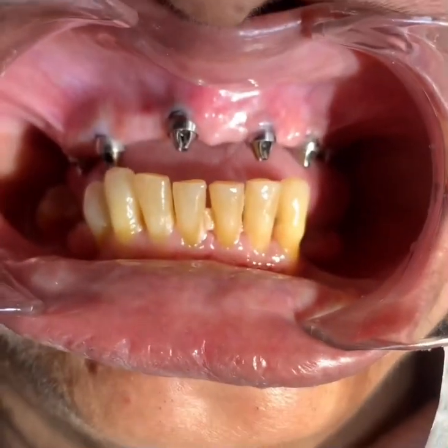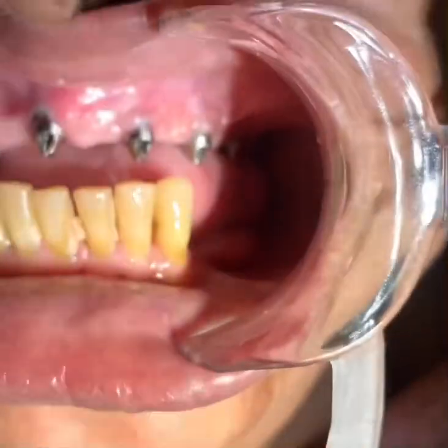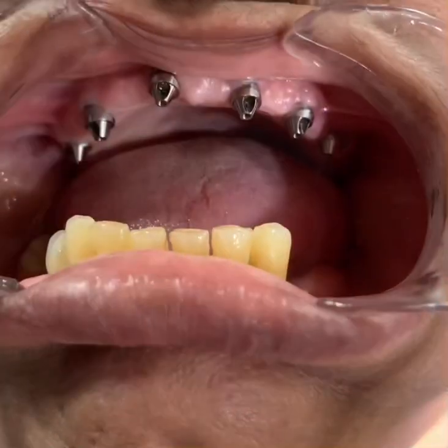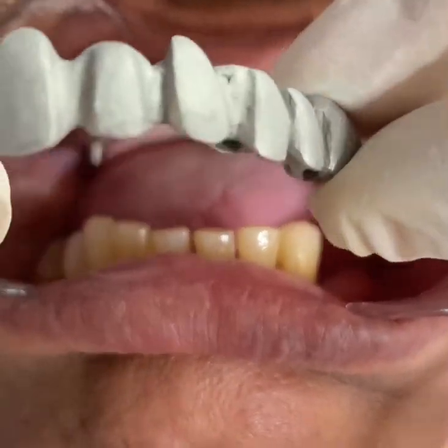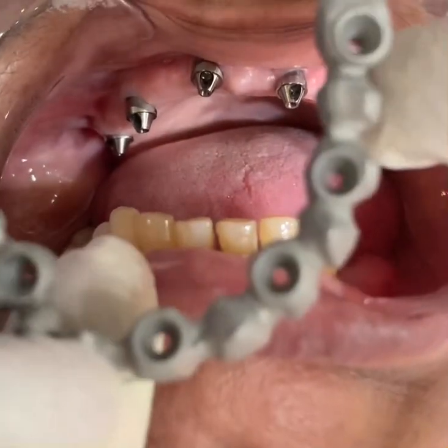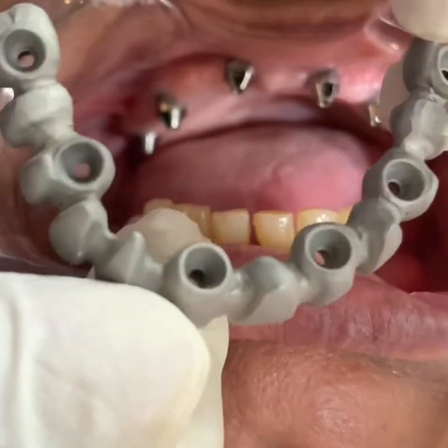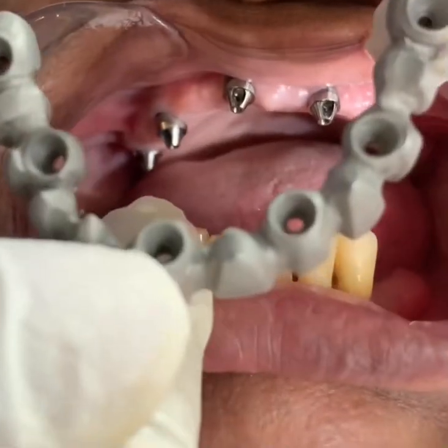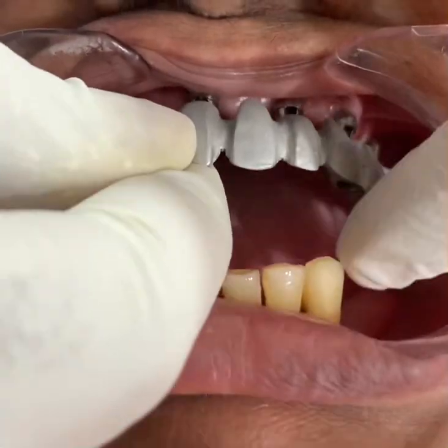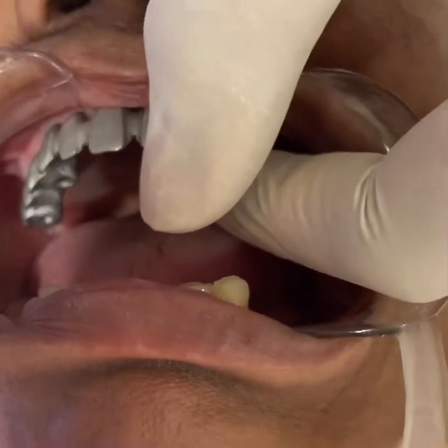I'll be showing you the framework — the metal trial of a casted metal framework. This is a casted metal framework; have a look at the passivity of it. We used plastic cylinders and got it casted from Precision Dental Studio, Thane, Maharashtra. Let's check the passivity and have a look at the individual components.